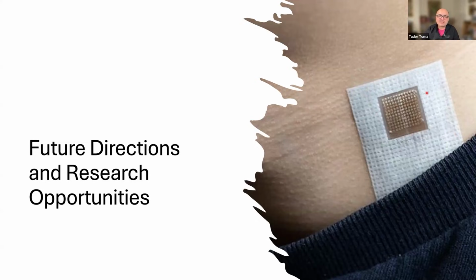I see it, for example, for monitoring patients with interstitial lung disease under treatment. So you can put this on a long-term basis on somebody's chest and give the treatment and see how the B-lines and the density of the lung change with the treatment or with the interventions.